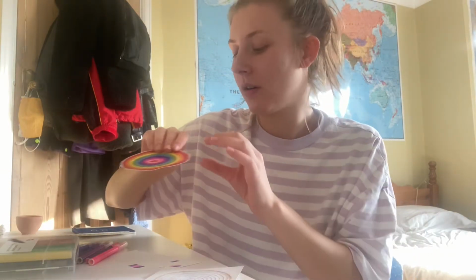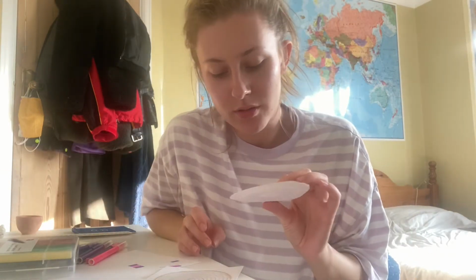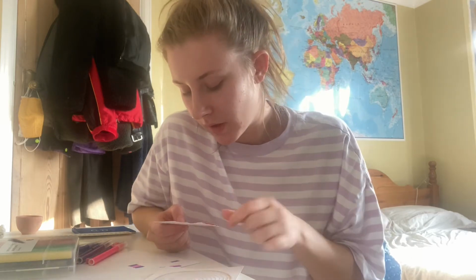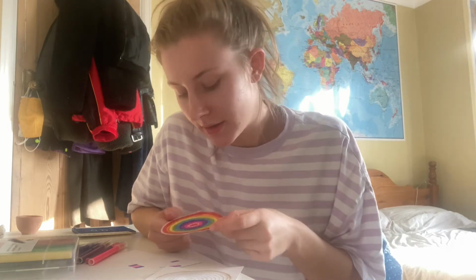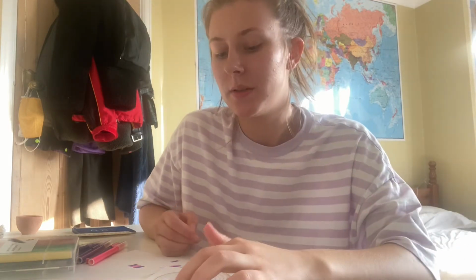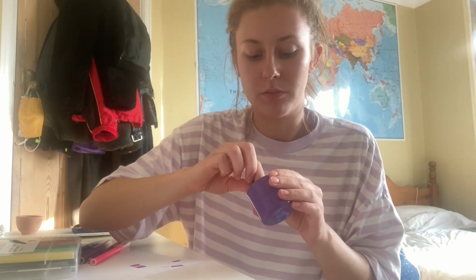So I did a couple tests. I couldn't remember last time whether I did the glue first or whether I coloured it in first, but part of me is thinking that I did the glue after last time and it made the colours run. And so I did a little patch test and I can colour over the glue. So what I'm going to do now is glue all of this before I do any colouring on it.